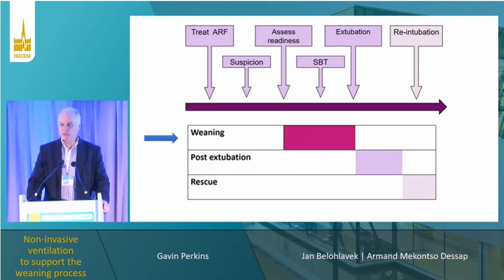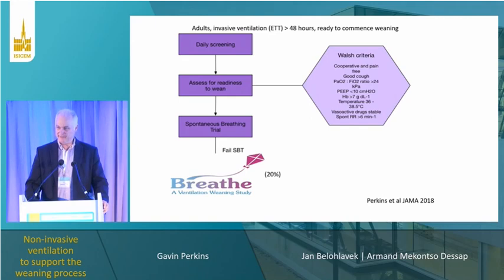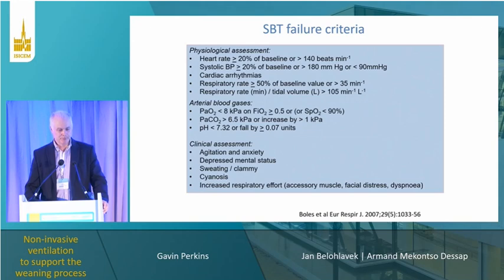So the BREATHE study, a UK-based study, randomised around about 500 patients who had failed a spontaneous breathing trial to either extubation and immediate application of non-invasive ventilation, or to continuing conventional weaning with repeating daily assessments of spontaneous breathing trials and then extubating the patient when they pass the spontaneous breathing trial.